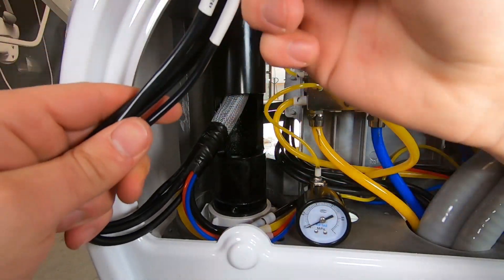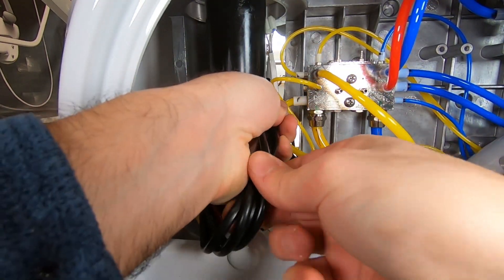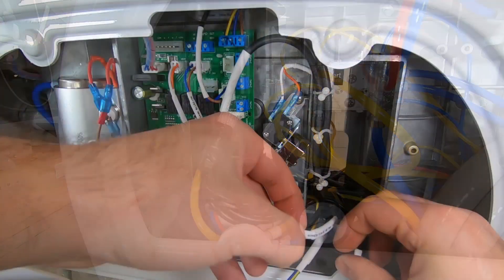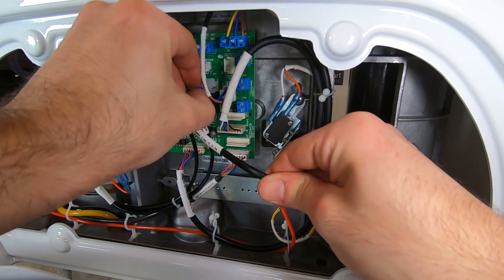Bring the cables up to the other side of the water unit and connect them to the water unit control board.